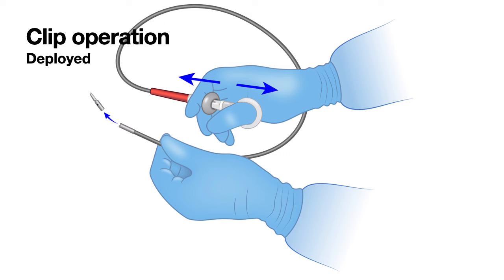So now let us look at some of the things that the endoscopist does when it's closing. When it comes to closure, the assistant should close the clip slowly. It is important to learn this, and I'll tell you why. So let us look at some closures.